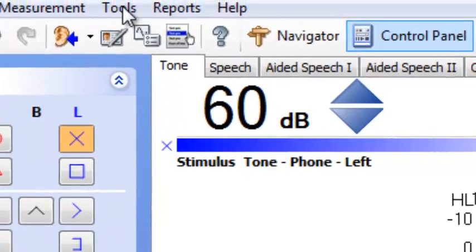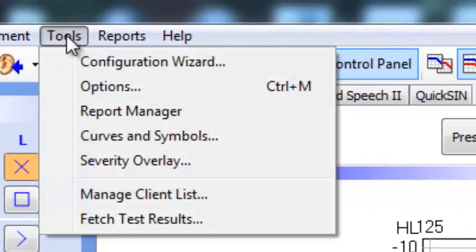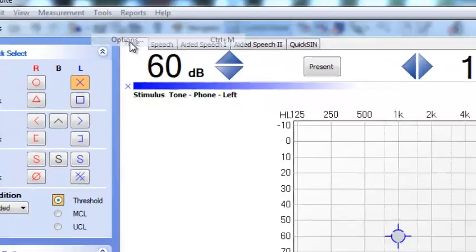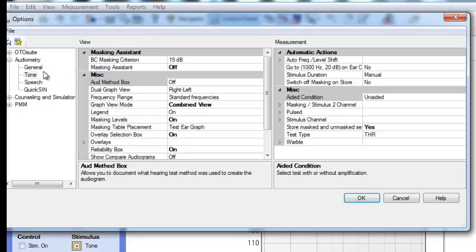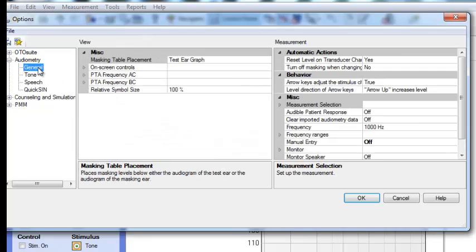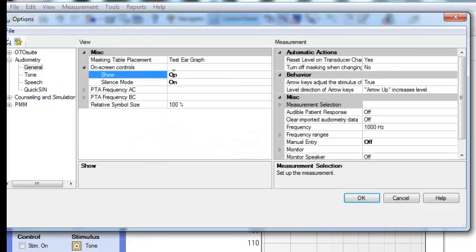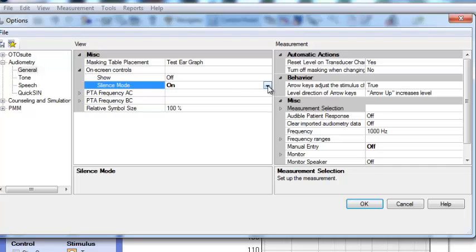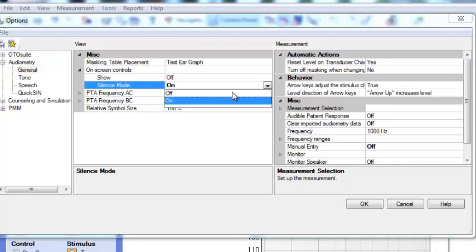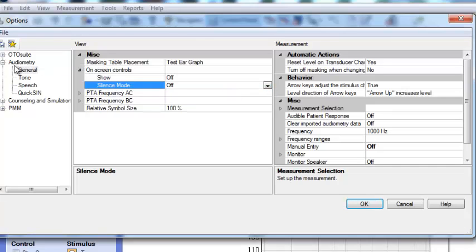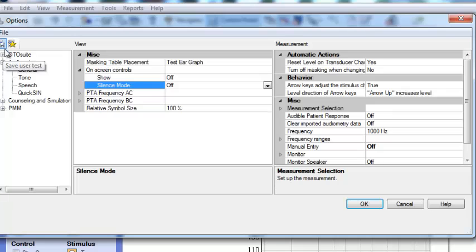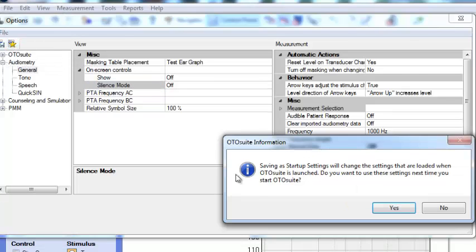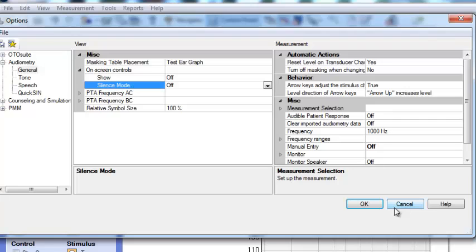You might not want that on screen so you go to Tools, Options, and it's under General. I need to switch off those on screen controls. And then just go to save as user test or save as startup settings. And that will remember those settings for the next time it starts up.